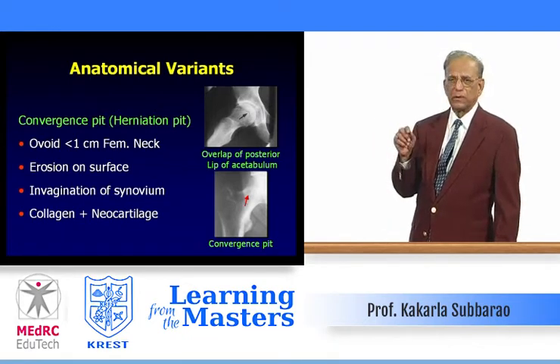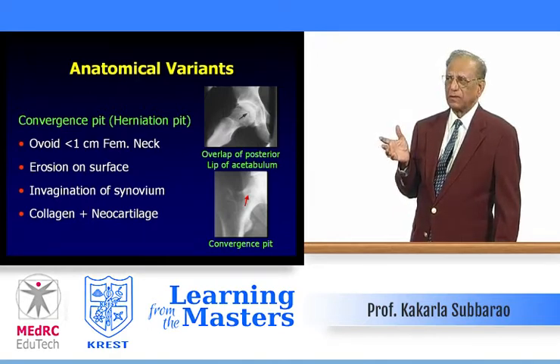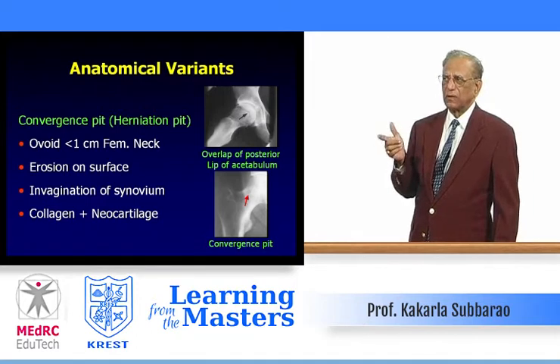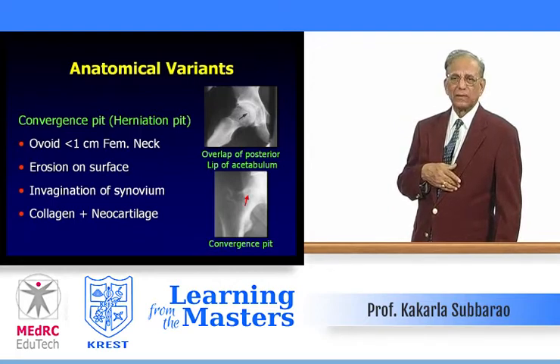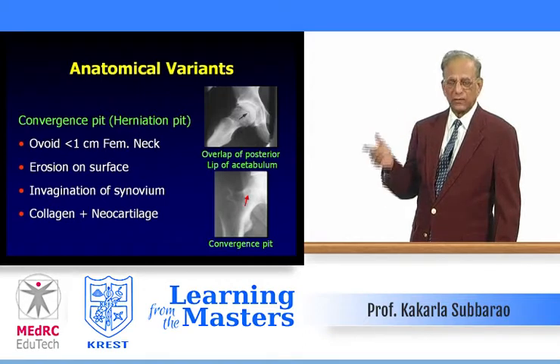Another example: somebody suggested it must be an osteoid osteoma because there is lucency with surrounding sclerosis. But osteoid osteoma does not typically occur in a 55-year-old male. Please note the patient's age and clinical condition before making a definitive diagnosis.